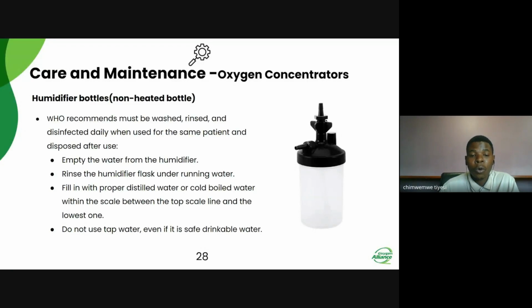So you should also make sure that you don't exceed the maximum and minimum scale lines on the humidifier bottle. You're going to see it later. They also advise that you should not use tap water, even if it is safe drinkable water, as it may still contain germs. But this often is not the case in low and middle income countries where resources are not available, which leads healthcare providers to reuse the same non-heated water humidifier bottle.